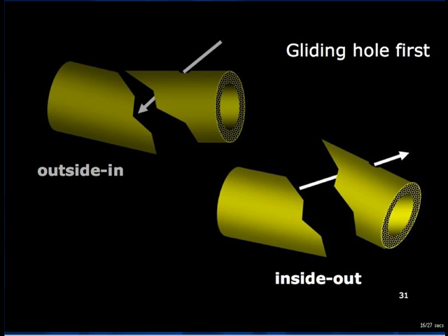This requires very careful rotation of the fragment to reach its endosteal surface. The biology of the fragment should not in any way be compromised by this manoeuvre.